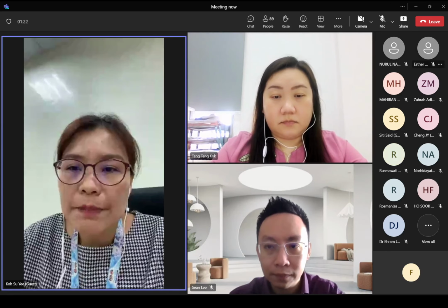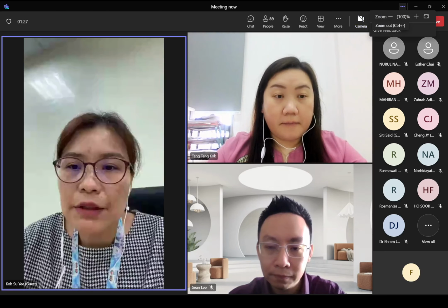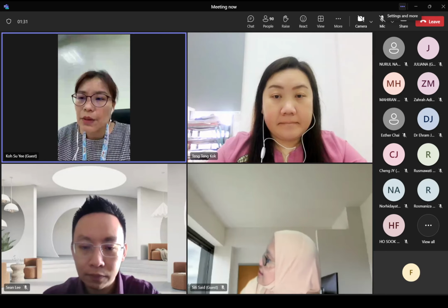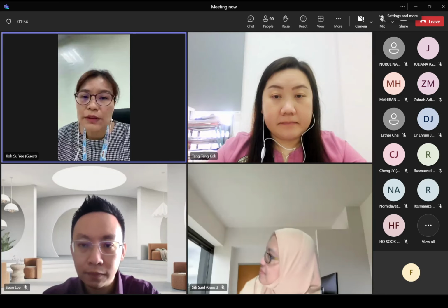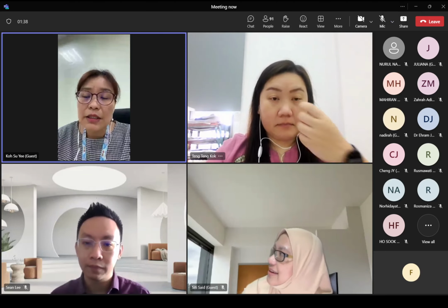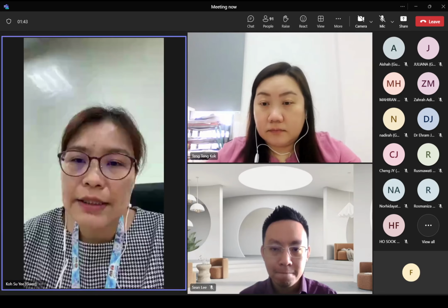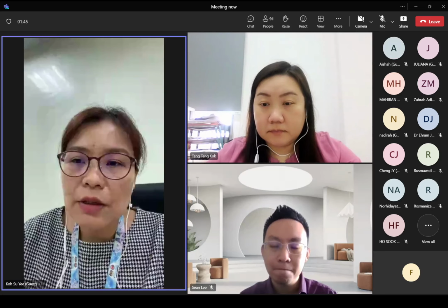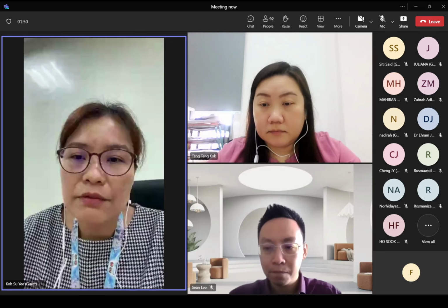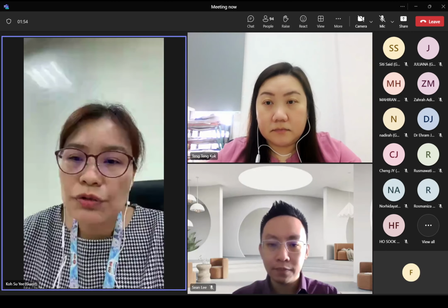Okay, from the lab perspective, management of a patient with CML requires accurate diagnosis, assessment of prognostic markers, and sequential assessment of level of residual disease. So, quantitative BCR ABL monitoring is mandatory, and so far it's the only technique that can quantify the disease level. Hence, the objective of today's webinar is to share the knowledge and experience in regards to this test. Okay. First, I would like to introduce our first.